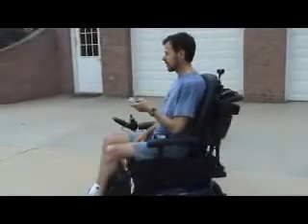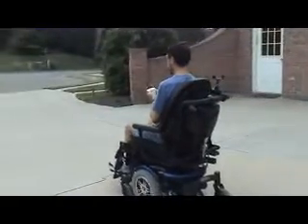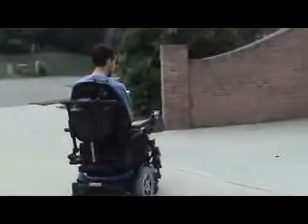Now I'm going to hit the straight ahead button, so we're straightening out now. Now I'm going to hit the right button so that we turn around. Make another pass.